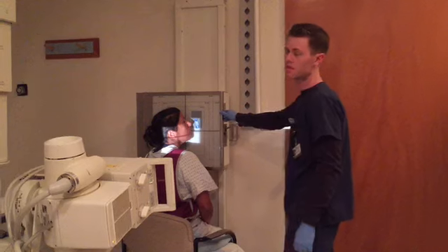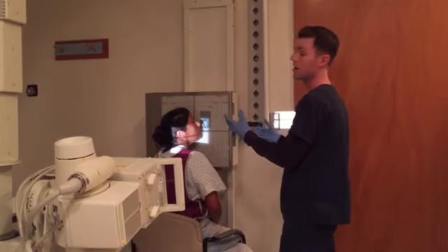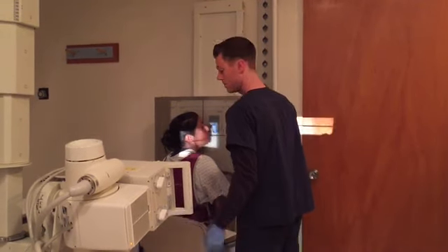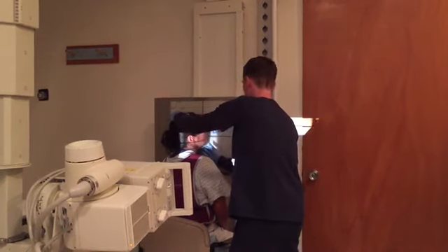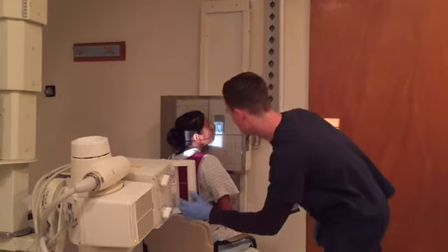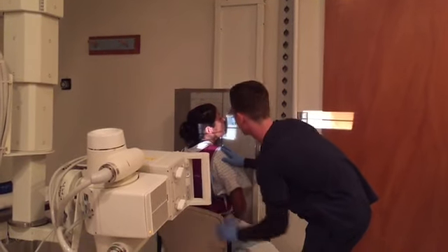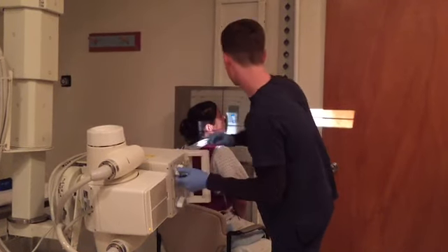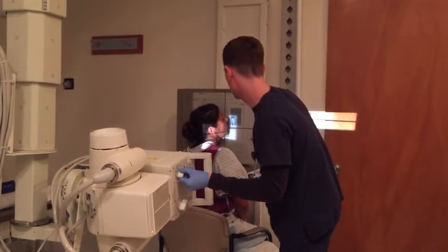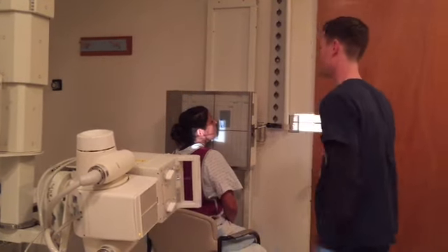Now we're going to do the symphysis. So that's just rotating the head another 15 degrees, so we're at a total of 45 degrees now. So rotate the head inward a little bit more, a little bit more. That's good. Enters the same place, and towards your left a little bit, right there. Cone down a little bit more. There. Same technique.